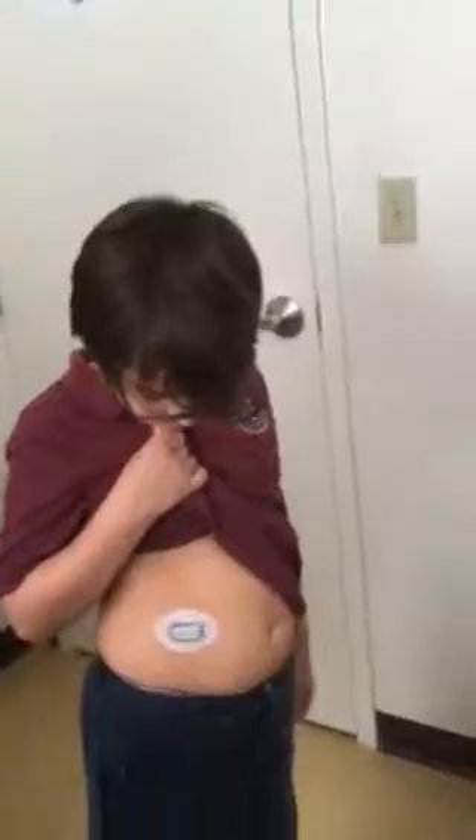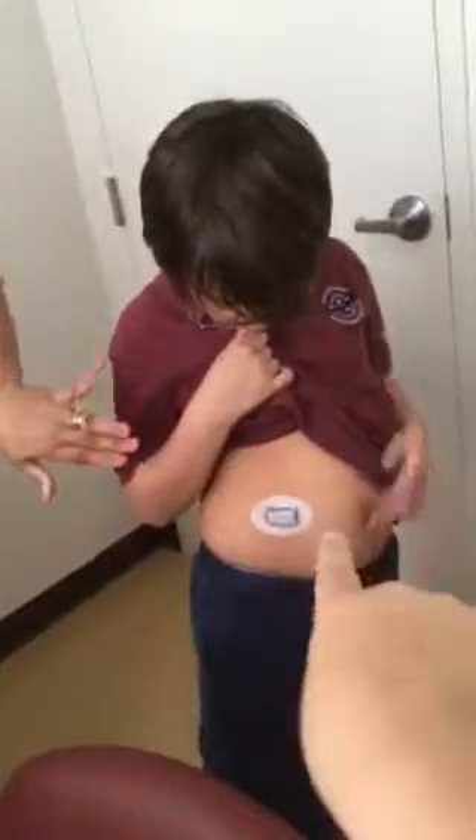What else do I need to tell you? When do I get to change it? Okay!